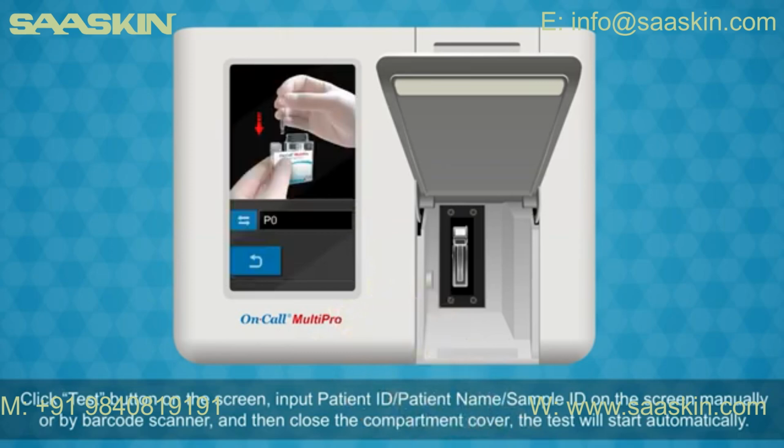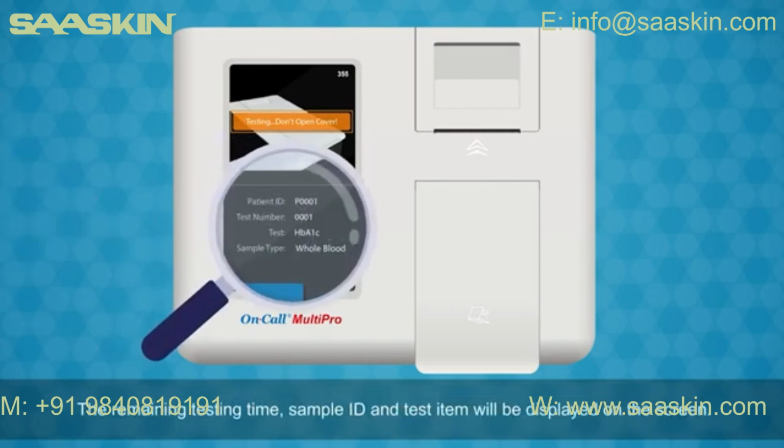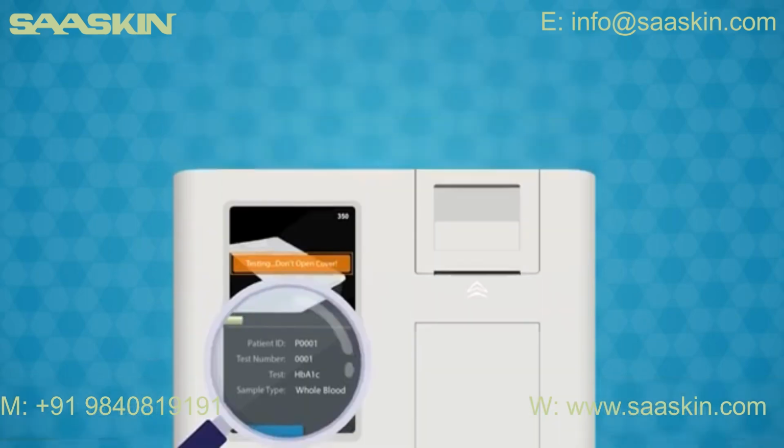Input Patient ID, patient name, sample ID on the screen manually or by barcode scanner. And then close the compartment cover. The test will start automatically. The remaining testing time, sample ID and test item will be displayed on the screen.